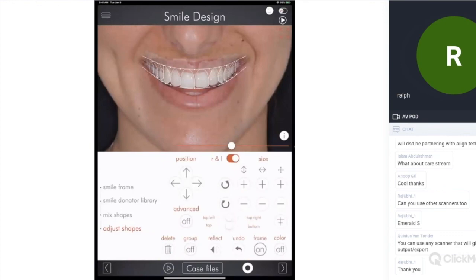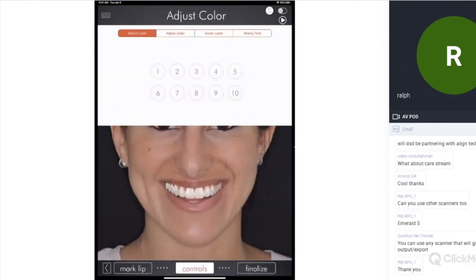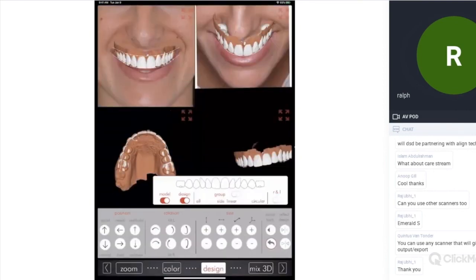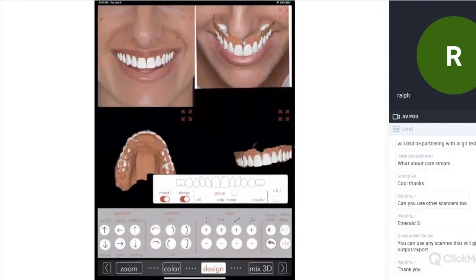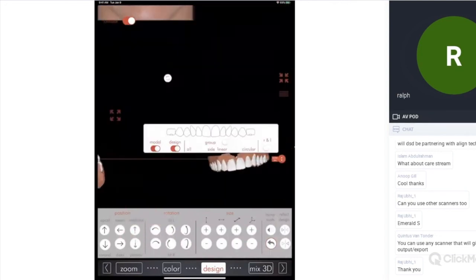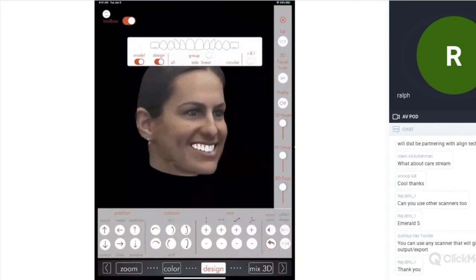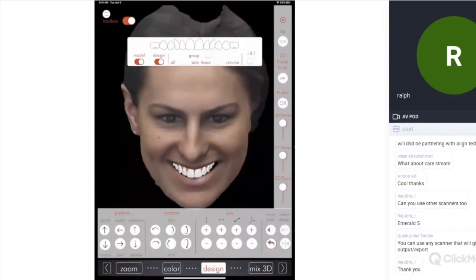So here we go. We have shapes, 2D, and we have the 3D design. Like this, so you can go and see and play, change the design, put the design in the mouth, redesign. That's the 12 o'clock picture. The idea is to define the wet dry border loop and to have the beautiful curve from a different angulation. And the most interesting here, you have also the facial scan with the 3D design, so you can adjust and compare now with the 3D smile design your 3D mock-up.